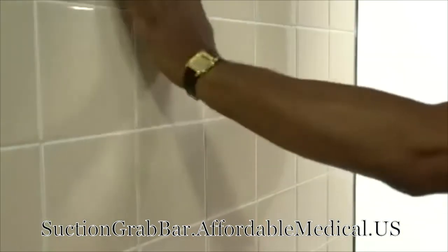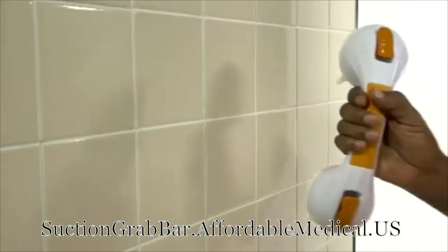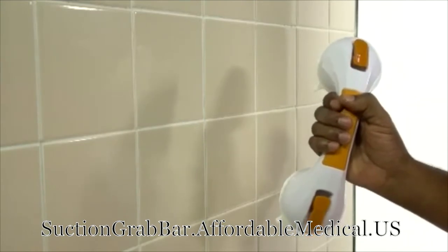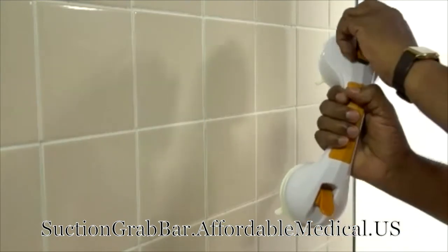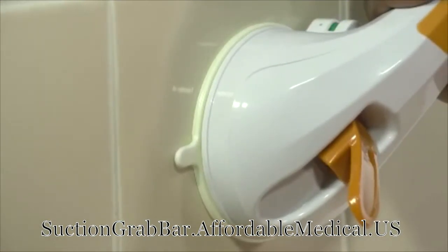Here's how it works. Start with any smooth, solid surface, such as ceramic, marble, or porcelain. First, make sure these vacuum levers are loose. Press the rubber disc to the surface and make sure the discs are not covering any cracks, joints, or grouting lines.